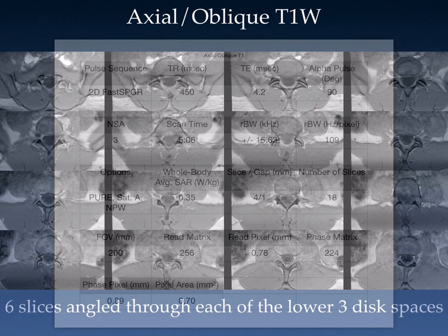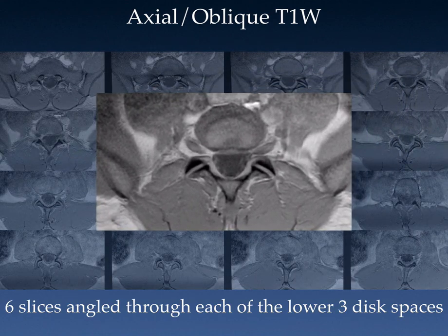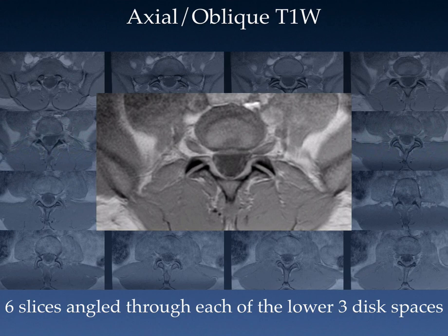Here are some sample images. We did three sets of six slices angled through each of the lower three disc spaces. As you can see, we've got good contrast. You can see the nerve roots quite well within the thecal sac, good contrast between the posterior intervertebral disc and the CSF, and out into the nerve roots. Facet joints are nicely seen, and the ligamentum flavum is nicely seen — really good quality contrast with quite adequate spatial resolution, all at low SAR values.